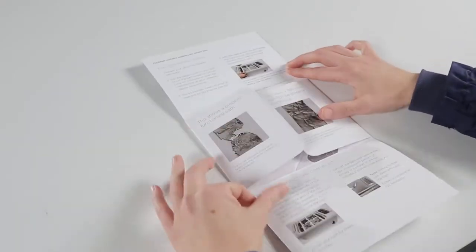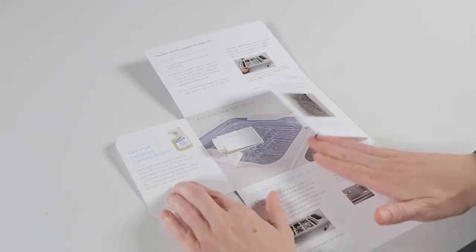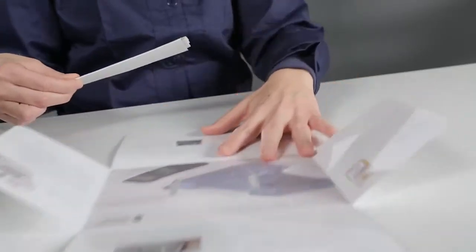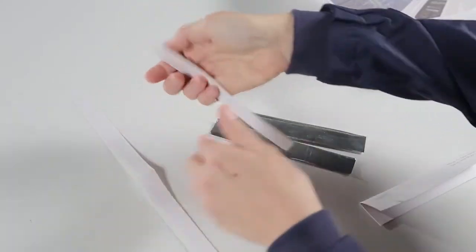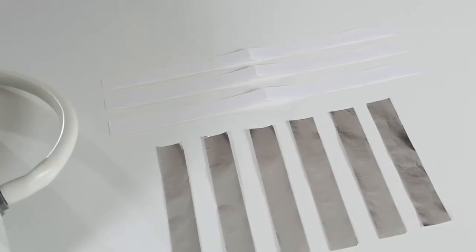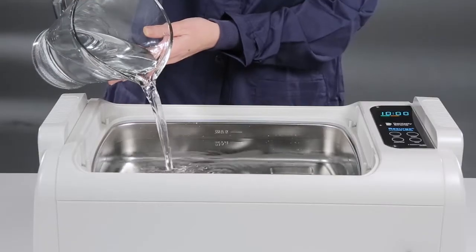Dentsply Sirona offers a simple foil test kit to allow you to quickly determine if your cleaner's transducers are working properly. The test kit consists of two parts: three strips of tape and six strips of aluminum foil.